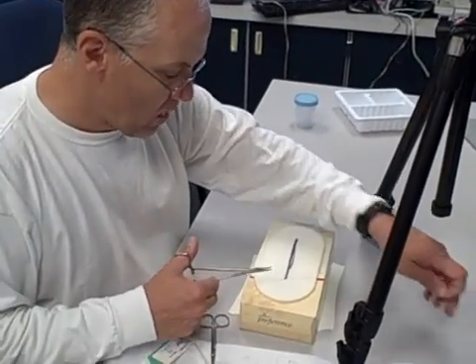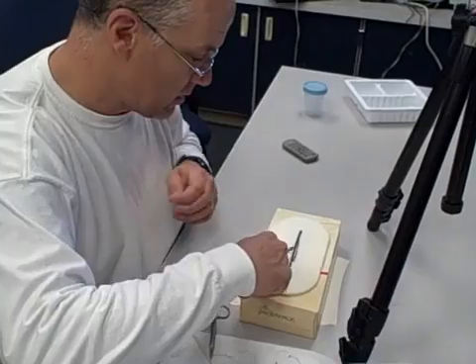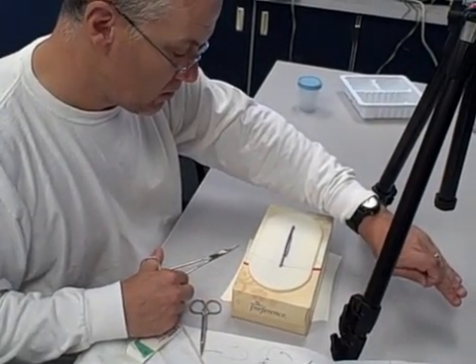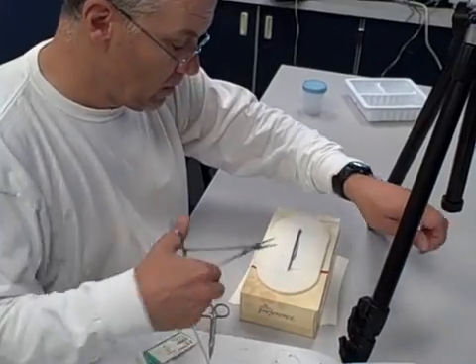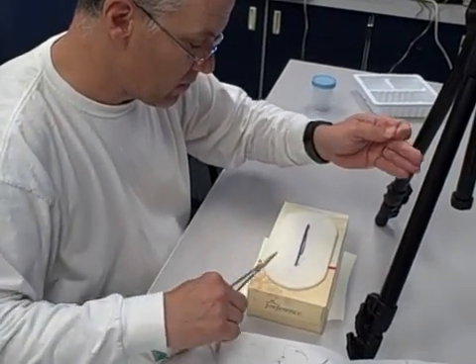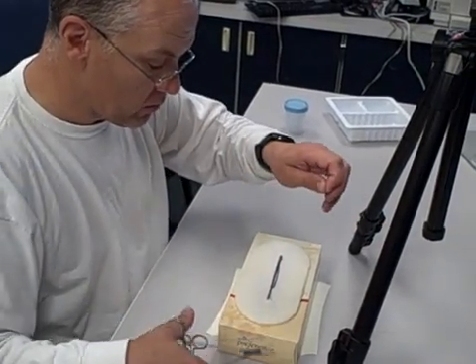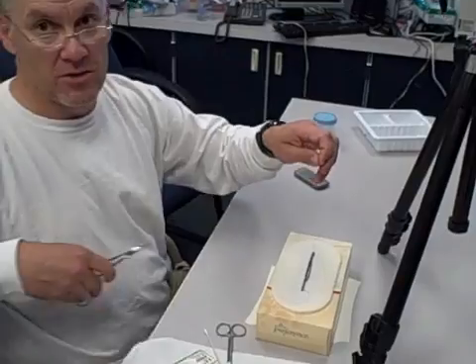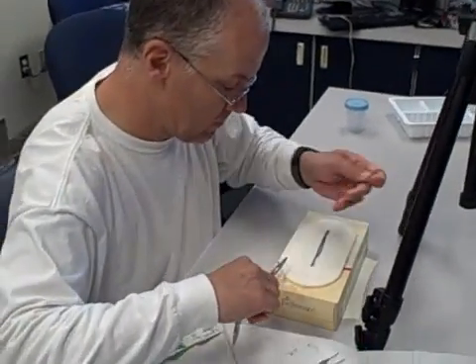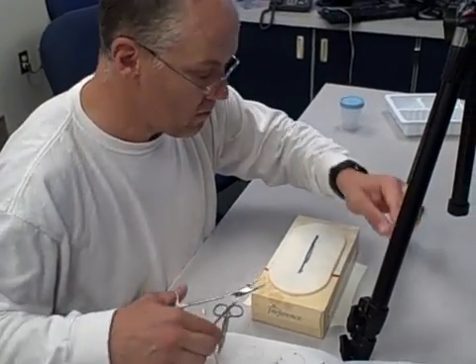Is that feeling pretty comfortable? Oh yeah, it feels way comfortable. I'll show you a little trick in one sec. Now the trick is to tell yourself not to cut that until you're all done and worked down. I tend to watch other people when they do it, and if I see a lot of puckering on the wound, I say you need to take that stitch out and start it. So the whole point when you're doing this is to loosely approximate but not strangulate — that's a good thing to teach your guys.